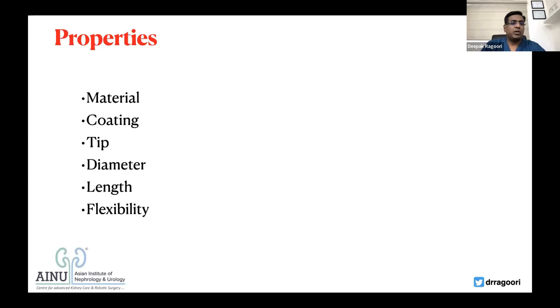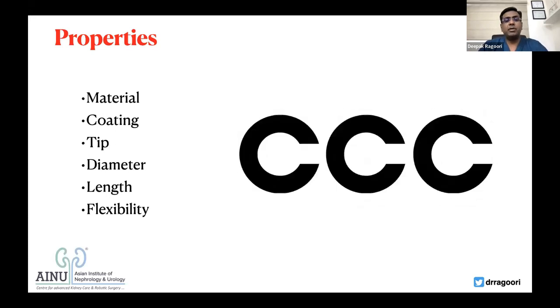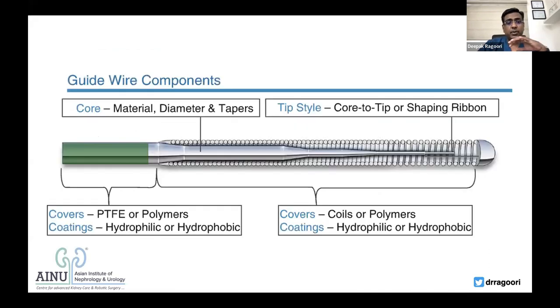So now I've come up with a short acronym. By and large, you can remember it as the 3 C's. What are those 3 most important things you should understand? Know about the core of the guide wire. You should know about the diameter of the guide wire to pick the right choice. And then you should know about the coating of the guide wire. Now, if you can remember these three parameters, by and large, you'll be able to pick your perfect choice of guide wire.